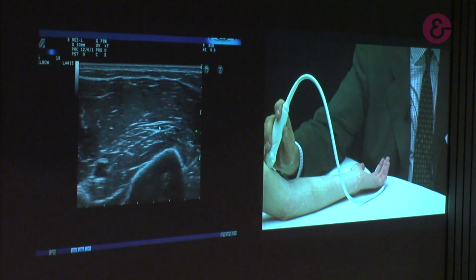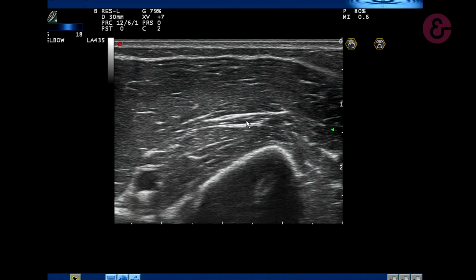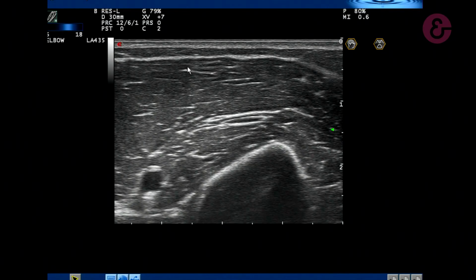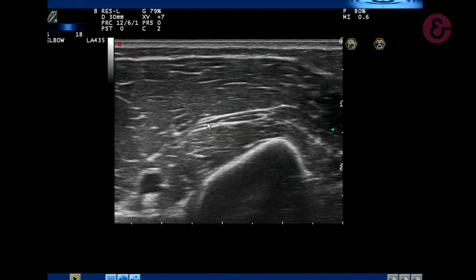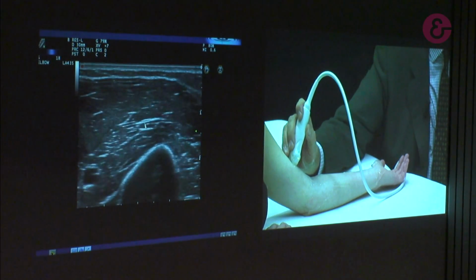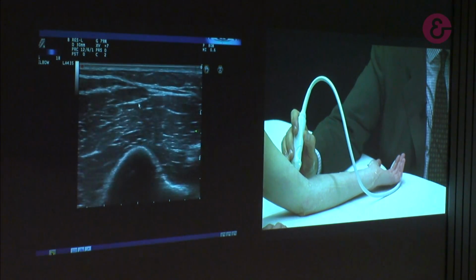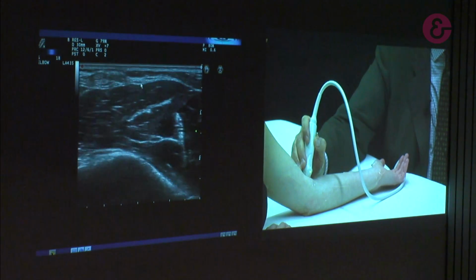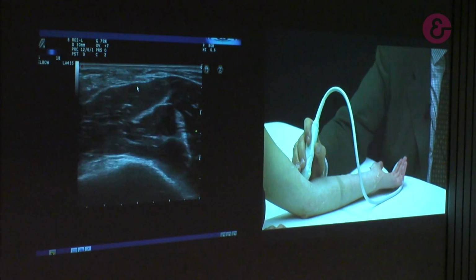upper extremity. Here, I am at the level of the middle third of the arm, anterior aspect. You have the humerus, you have the brachialis anterior, you have the biceps muscle. And this is a nerve running in between the two, which goes farther. You can follow it. And you can see it going to the subcutaneous tissue as the lateral antebrachial cutaneous nerve.